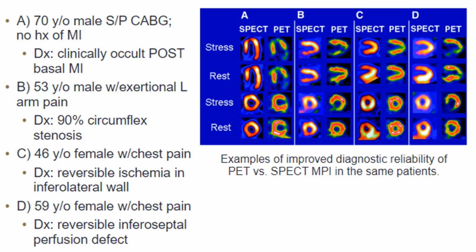This is just a comparison of the reliability of PET versus SPECT. I wanted to point that out to you guys because it is preferred if you are doing a viability study to do FDG over thallium, and it is also preferred to do the PET resting study over a SPECT when you're comparing it for viability purposes. And this is showing you why in these images here.